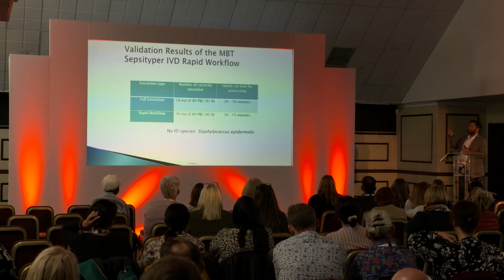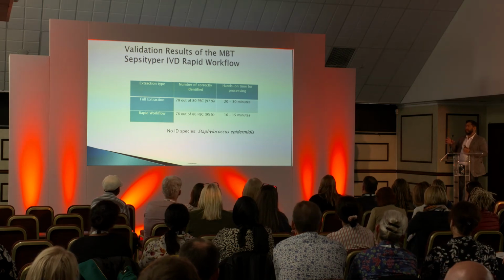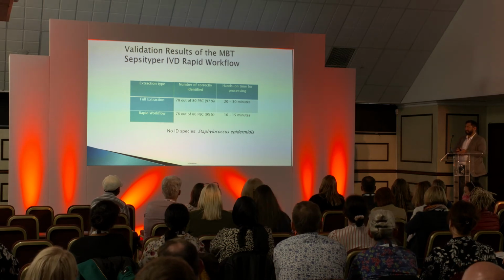But I think the significant part of this data we need to look at is that the full extraction is about 20 to 30 minutes hands-on time, and then the rapid workflow is 10 to 15 minutes. So we're always trying to work to reduce the time to identification.